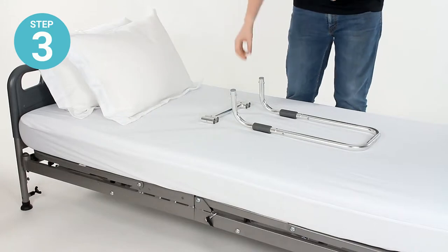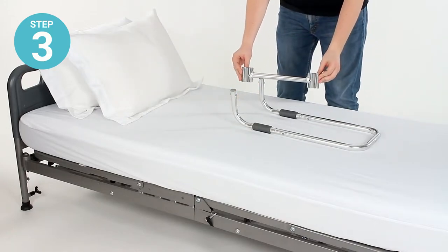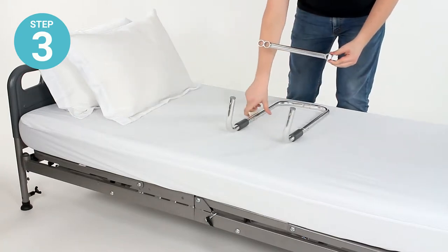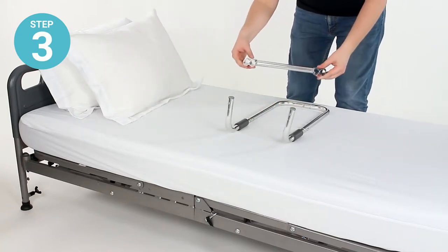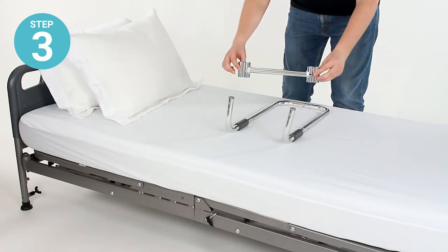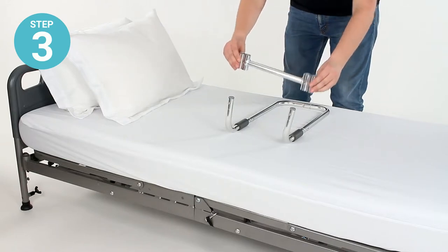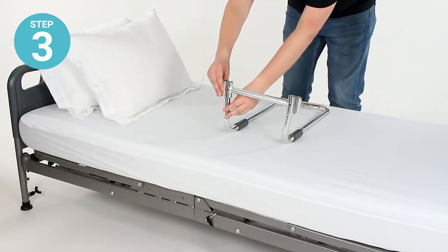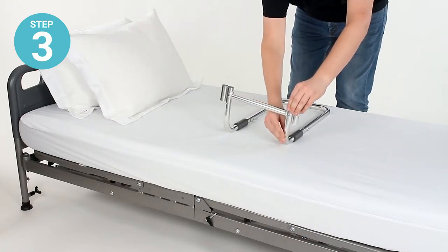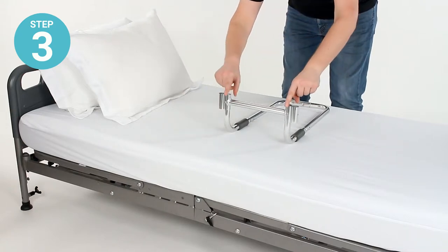Step three: take the crossbar and fit the upturned ends of the short elbow rails into the inner set of holes on the crossbar — those are the tubes marked with the little locking pin holes. Fit those over, pinch the locking pins down, and press down until they lock together.